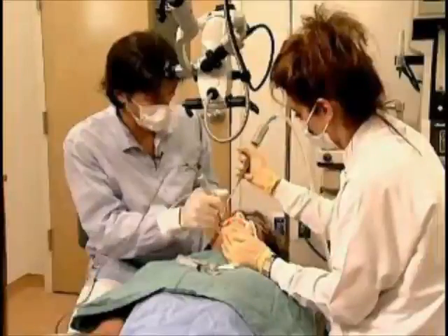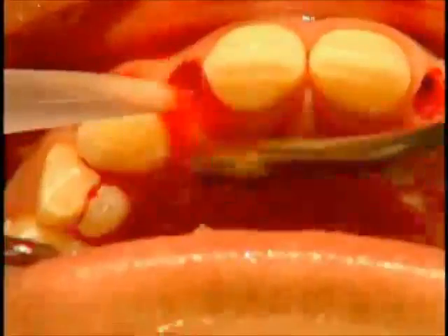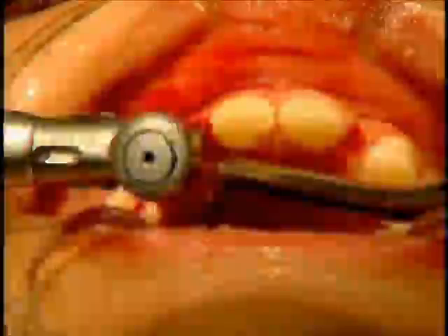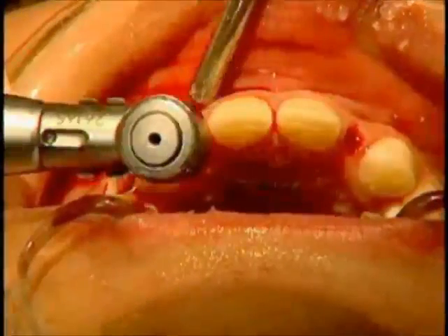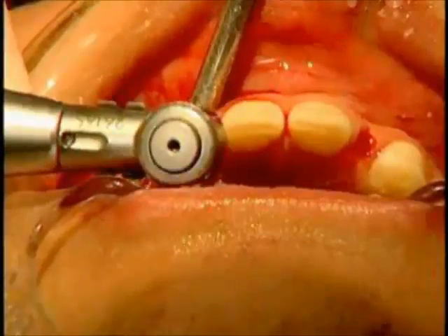Just suctioning up the bone. It's coming out of the site. Clean that up a little bit. I'm just going to make sure I have room subgingivally, and we're going to try to do this as a one-stage procedure.